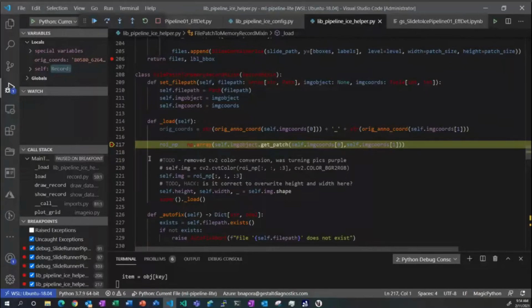I mentioned there are hundreds of thousands of annotations in this particular data set from the folks at FAU. And so we have the luxury of having really large numbers of patches, and creating those and writing them to file for each iteration is certainly cumbersome.